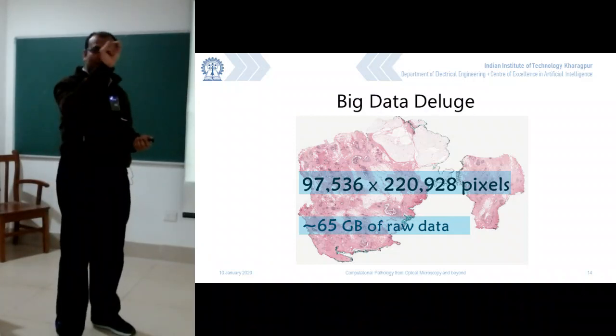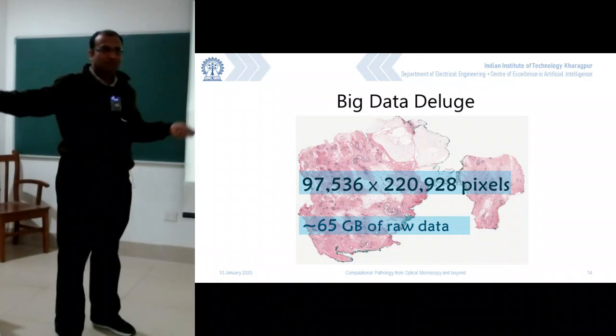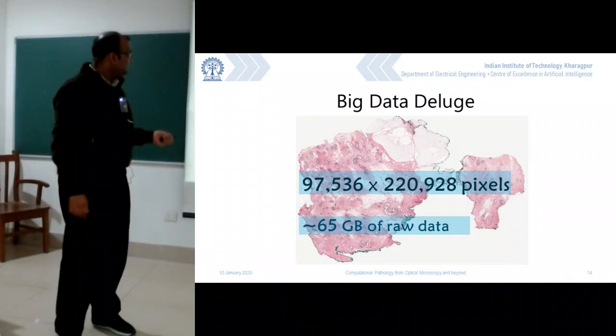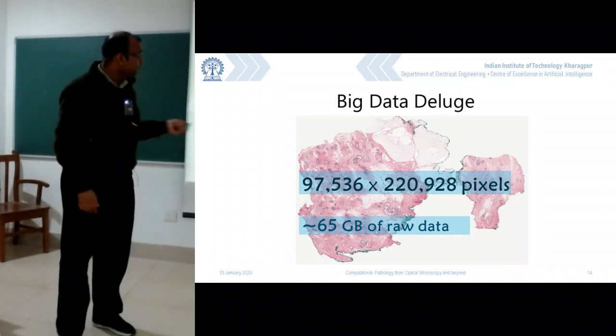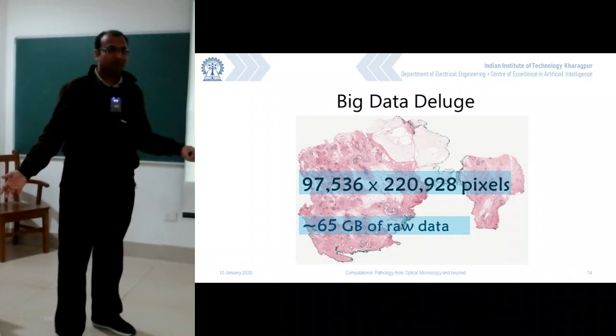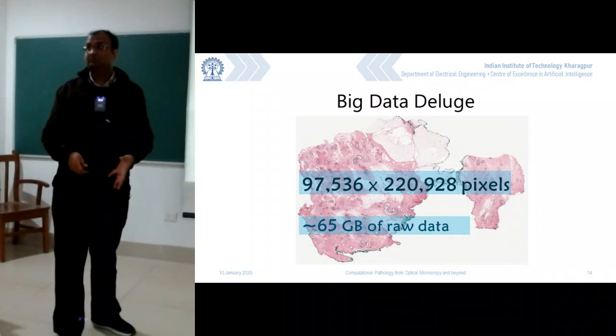So you can have every position and then link it to which is the next position, and then you keep on storing that as a linear string over there. So that's very simple, like a PDS lab level assignment, which is done in order to create this file structure. Still, the problem is that if you have more pixels, you are still going to have more space requirement. Now the question comes: can I reduce that?